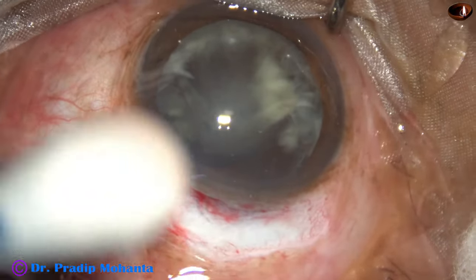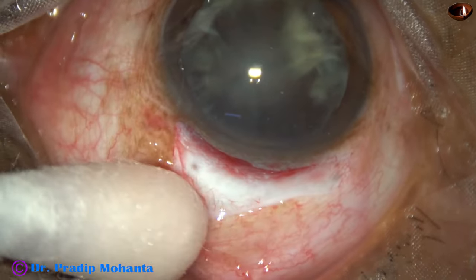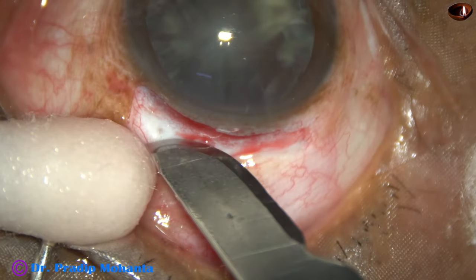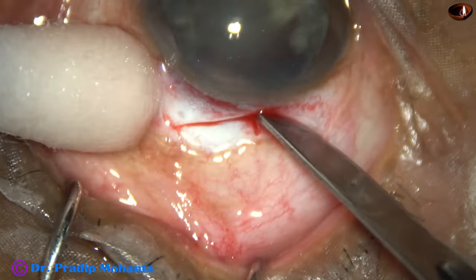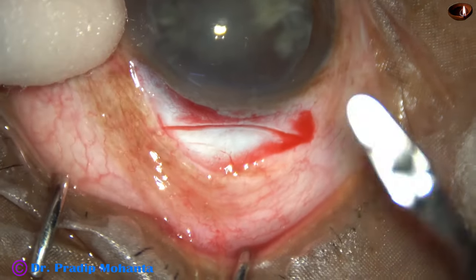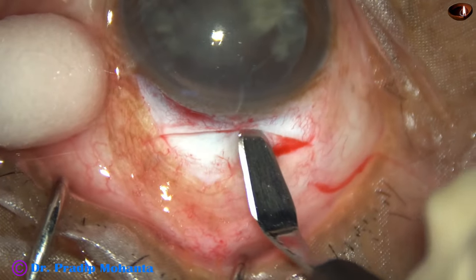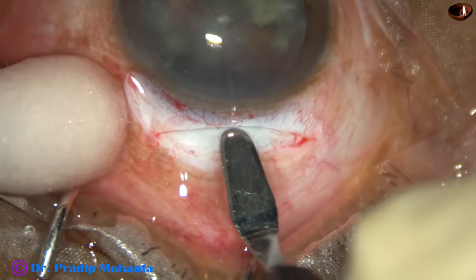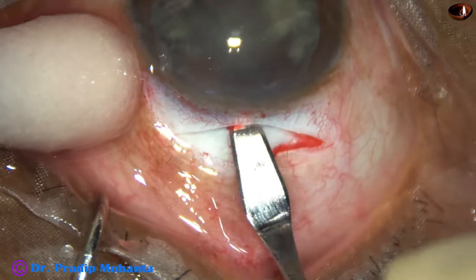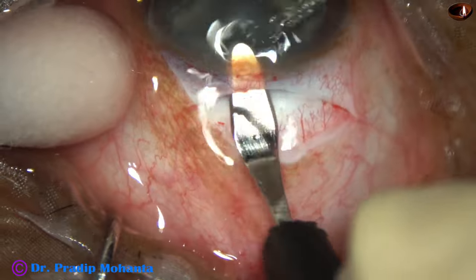Let us see how much peritomy there is. Peritomy is about eight millimeter and I am giving this incision for seven millimeter. This is a mild frown incision. When the incision is like this, we do not need any suture. This is almost half thickness depth incision. And now we are going to make the tunnel. The crescent blade goes into clear cornea for about 1.5 millimeter.